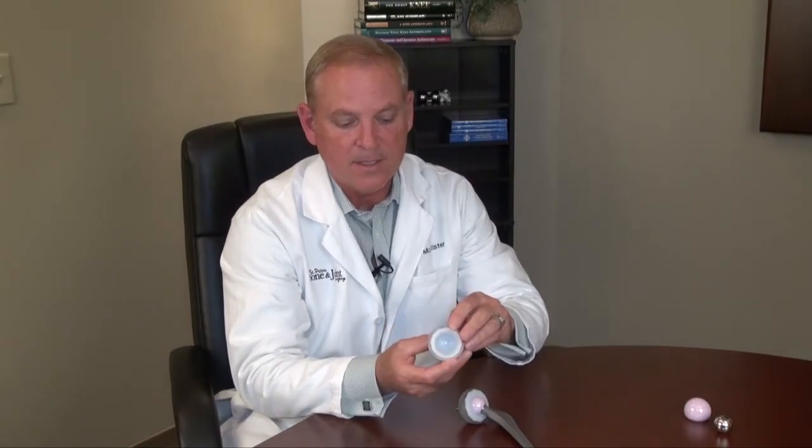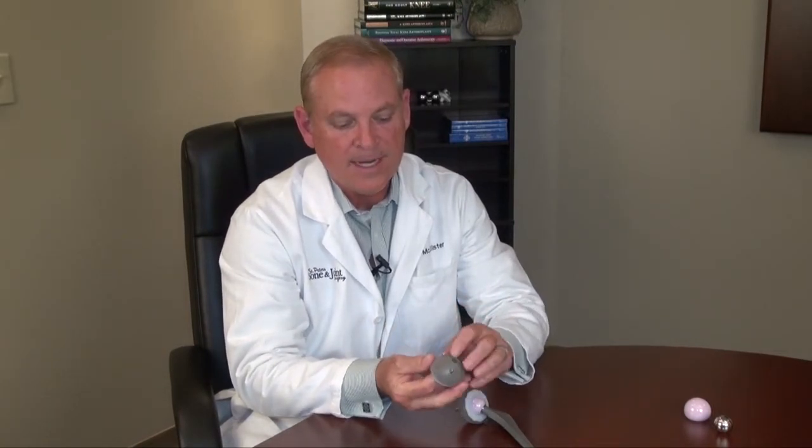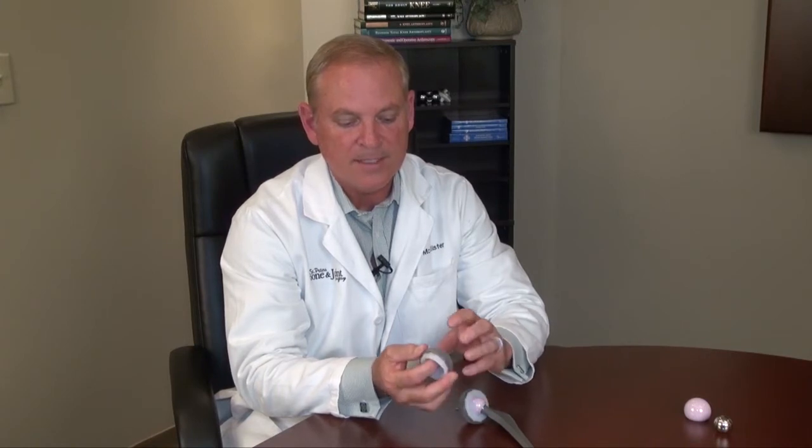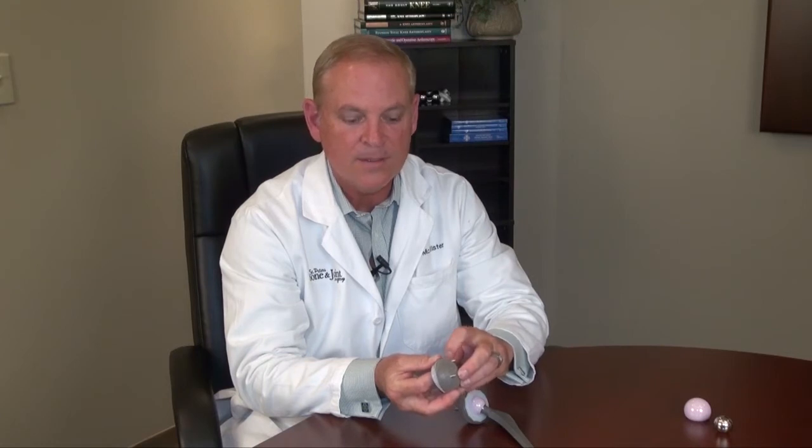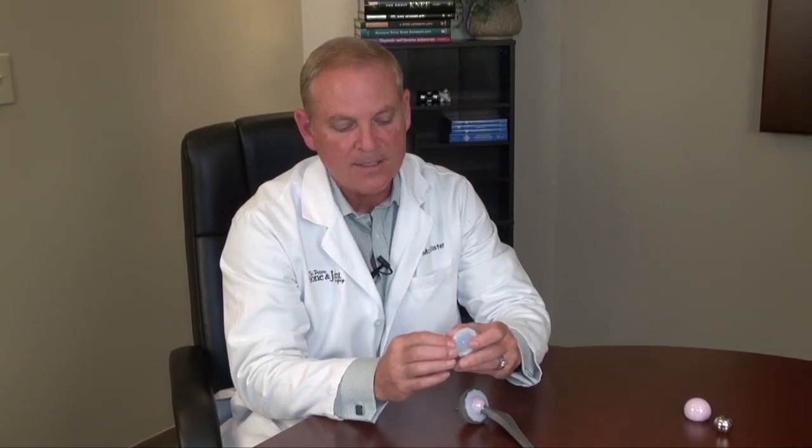The hip is taken out of the socket, we remove the ball, and then we're looking at the socket part of the hip, and I replace that with this type of device. This is a metal titanium component. It looks a little scary with these little spikes, but that just basically helps to hold it in the bone initially, and the bone will actually grow into this rough surface. Then it has a plastic liner that snaps in, and once you hit this, it locks into place.